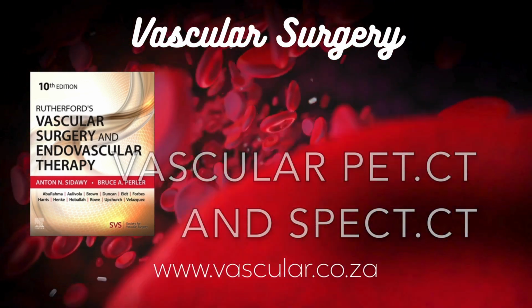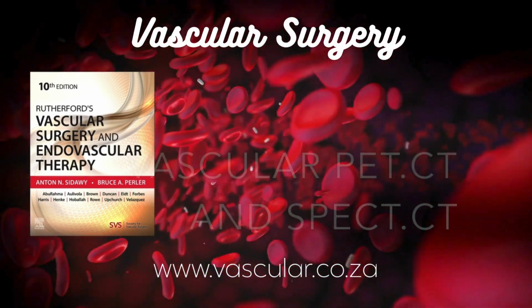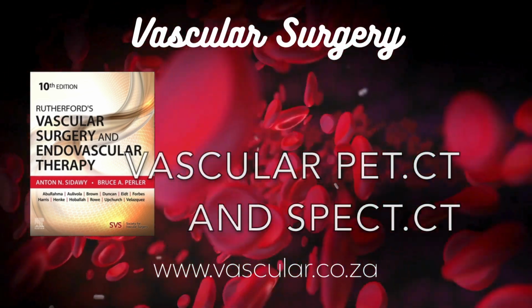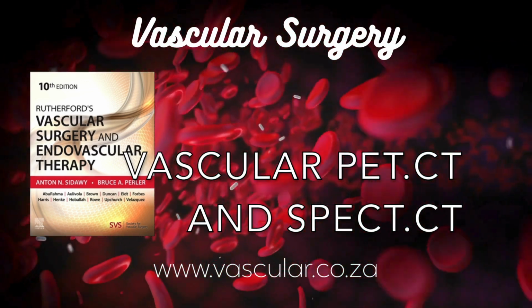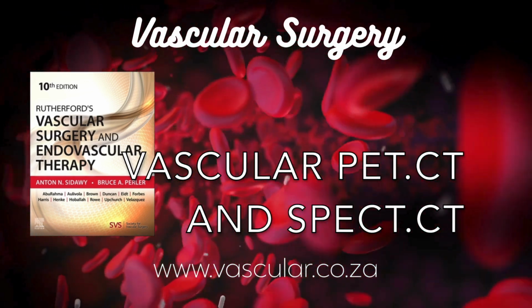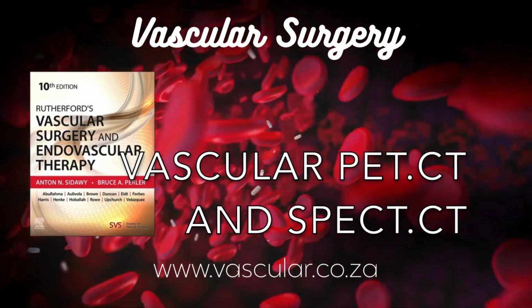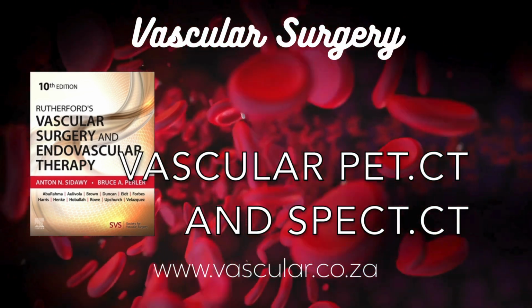Sequential PET-CT scans can monitor the effect of treatments. Animal studies showed certain drugs could reduce FDG uptake in plaques. And in people? Yes. Human studies using statins, like simvastatin, have shown reductions in arterial wall FDG uptake over time, alongside the expected drop in LDL cholesterol. This inflammatory reduction might happen even before you see significant structural changes on, say, MRI. That's interesting. So the metabolic change might precede the structural one. It seems so. And interestingly, significant lifestyle changes like diet modification have also been shown to reduce the extent of FDG-positive vascular regions. That's really powerful, seeing a direct impact of lifestyle on vessel inflammation.